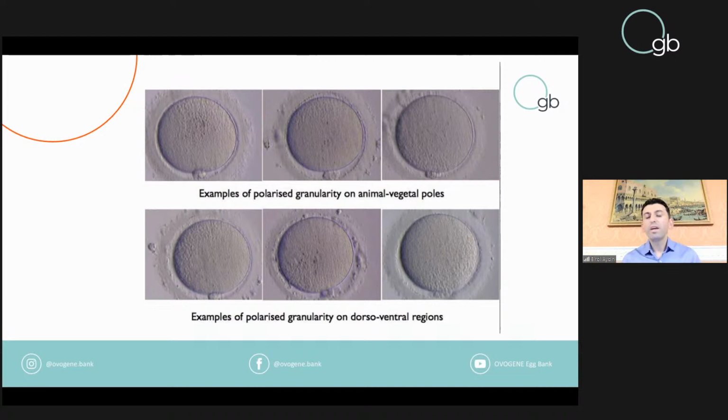That's why we are using a liquid crystal analyzer. It's a kind of laser. It goes deeply inside the cytoplasm and measures the percentage amount of granulation. That gives us the advantage of knowing which oocyte is really in a risk group after warming.